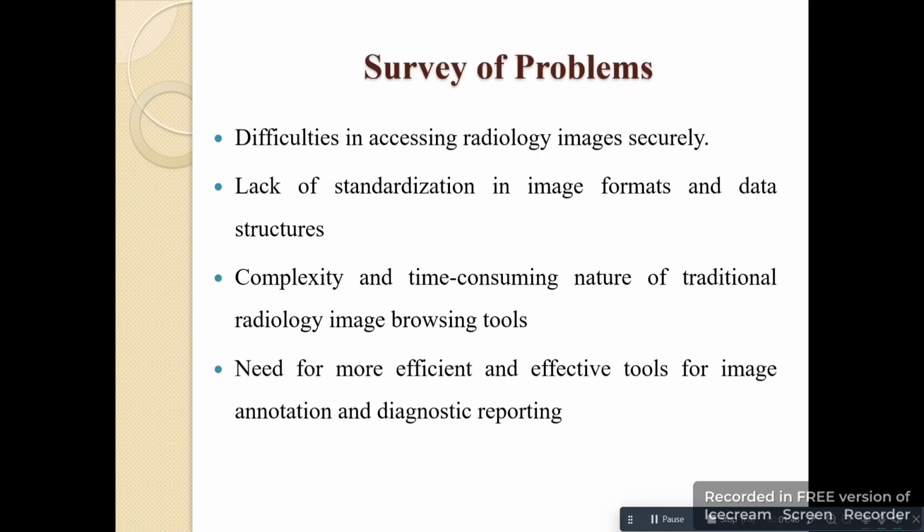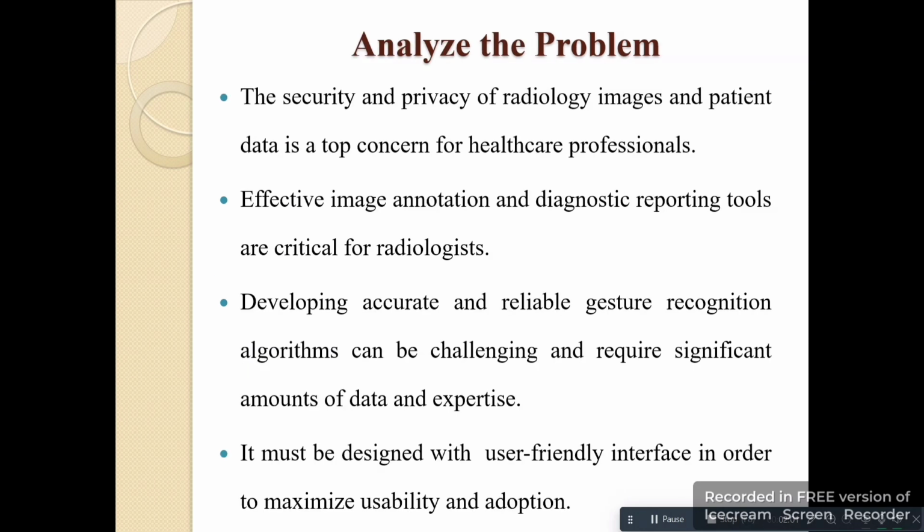Difficulties in accessing radiology images securely. Lack of standardization in image formats and data structures. Complexity and time-consuming nature of traditional radiology image browsing tools. Need for more efficient and effective tools for image annotation and diagnostic reporting.